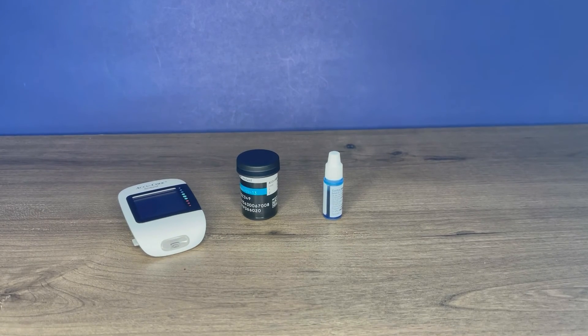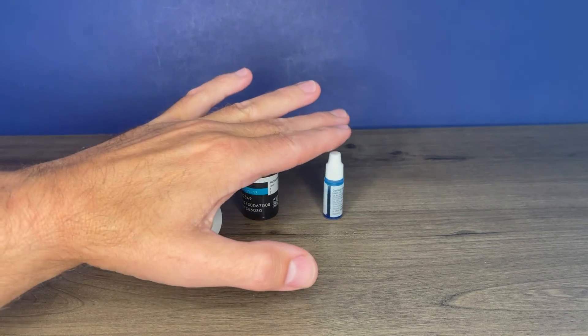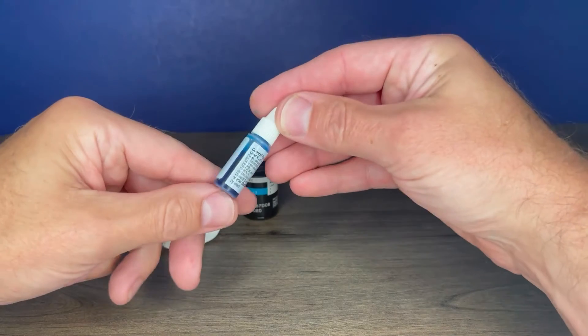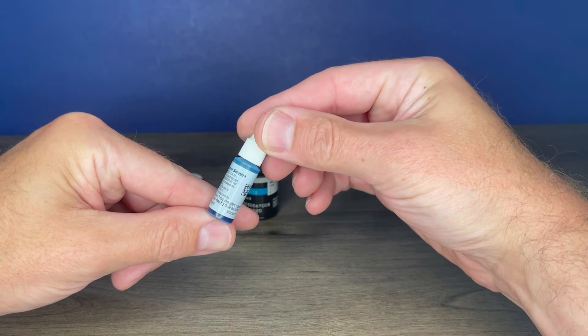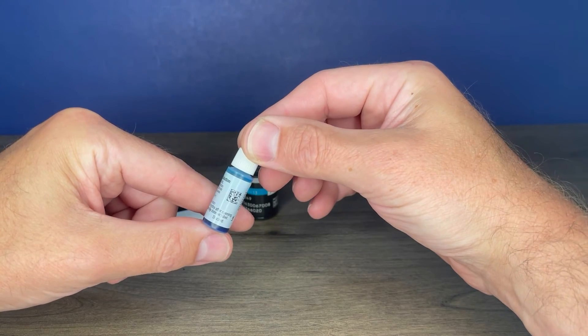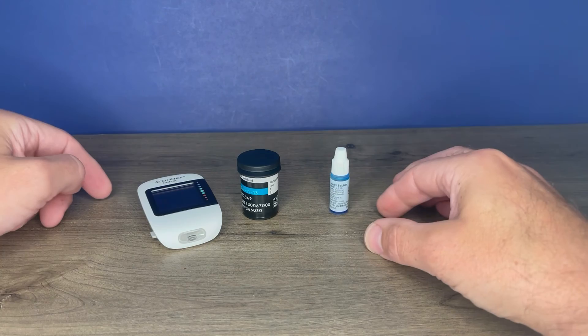So let's perform a control solution test. To do that, you will need your meter, your test strips, as well as AccuCheck Instant Control Solution. Your control solution may look slightly different — I cannot get the AccuCheck Instant Control Solution here in the US; however, this is equivalent. This is the same control solution that you would get. The bottle just may appear different.